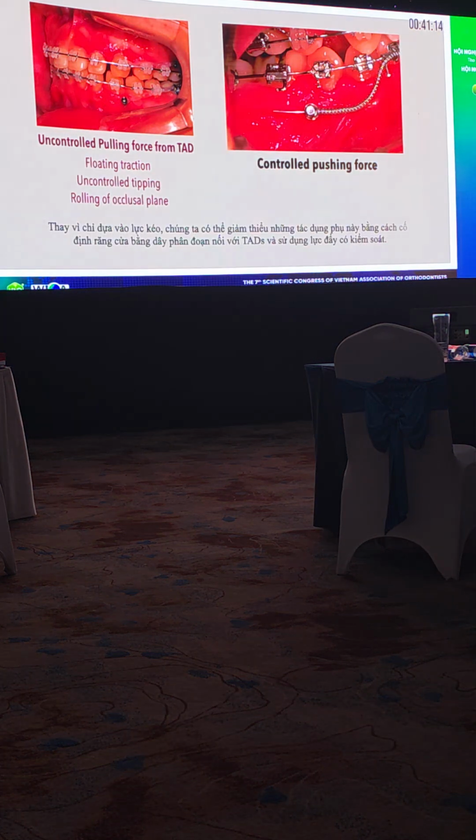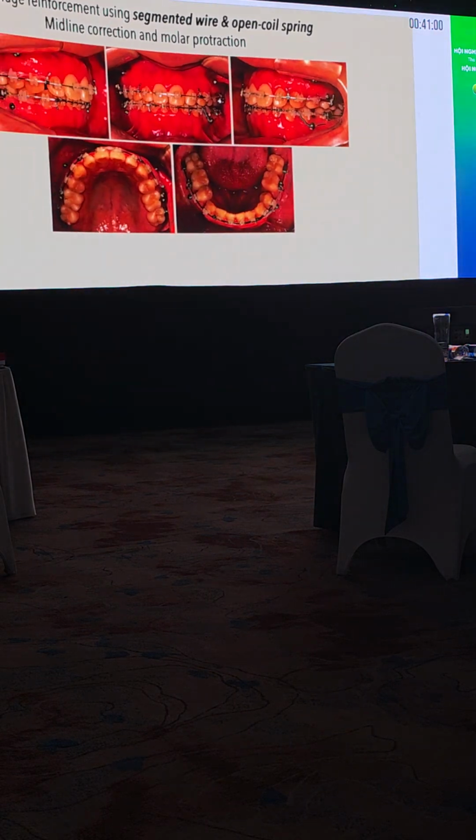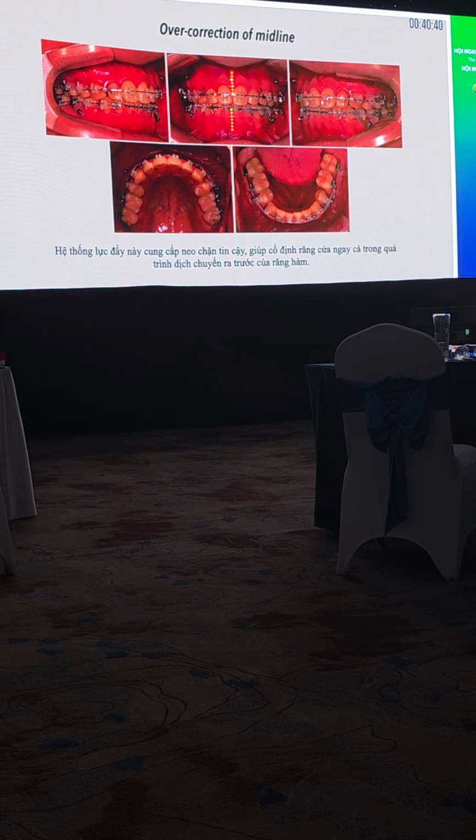Instead of relying on pulling force, I can minimize these side effects by stabilizing the incisors with a segmented wire connected to the TADs and employing controlled pushing force. In case 1, I applied TAD-supported pushing force by connecting the TADs to the mandibular incisor region with the segmented arches, and utilizing an open coil spring, so we can successfully improve the midline. This pushing force system provides reliable anchorage, stabilizing the incisors even during the forward movement of the molars.